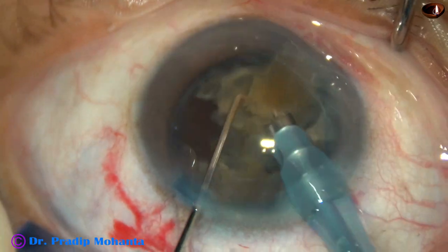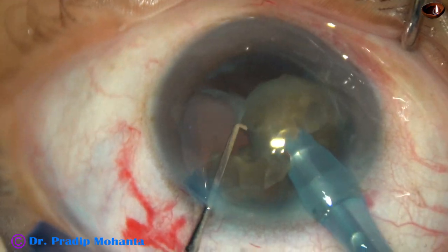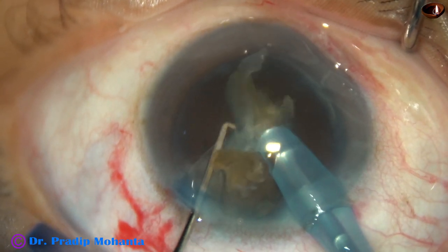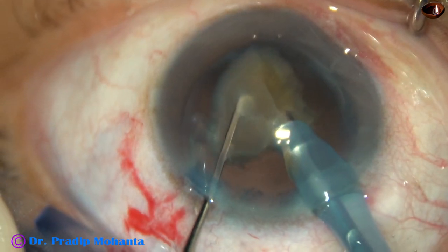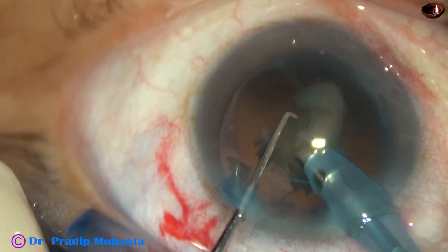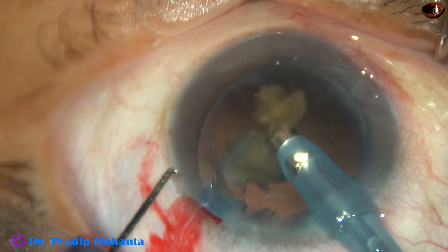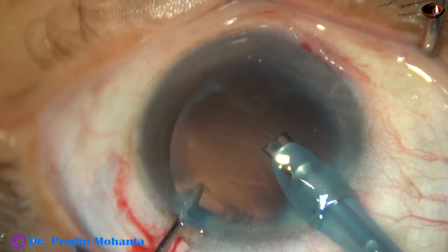Each nuclear fragment is being emulsified and the anterior chamber is very stable. The behavior of the posterior capsule is noted. For the last nuclear fragment, after emulsifying half of it, settings are reduced to PHACO mode where vacuum is only 80 mmHg, flow rate is 25 ml/min, and ultrasonic energy is 60%. The nucleus is conquered and small nuclear pieces come out through the side.